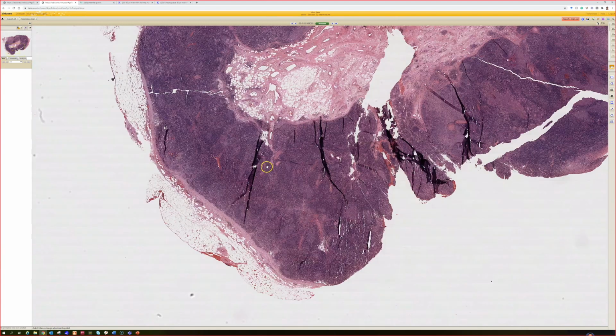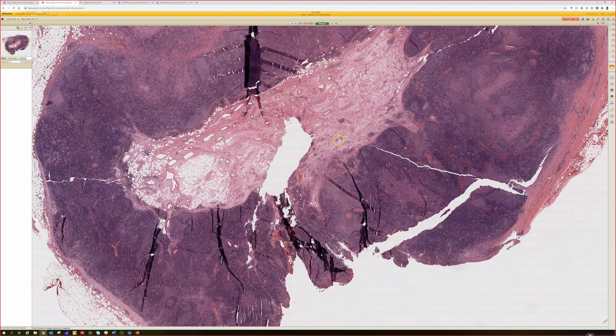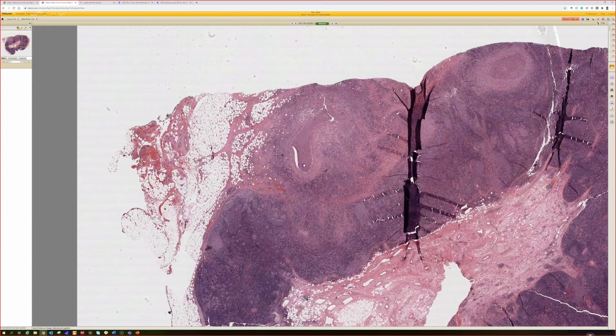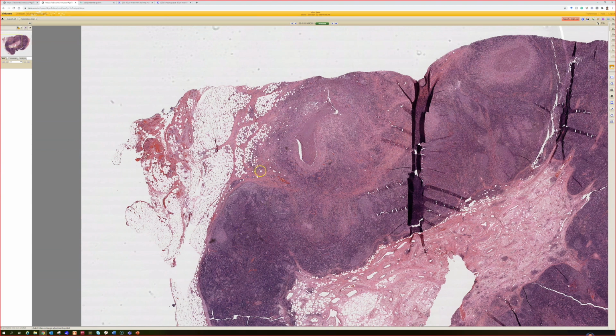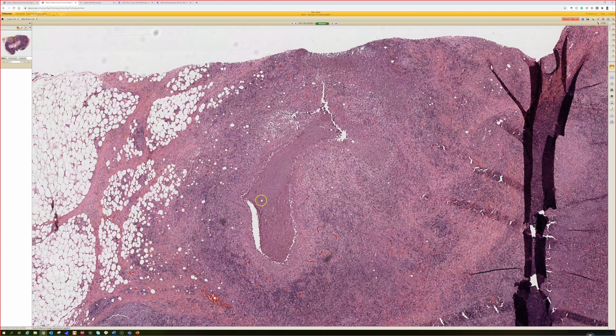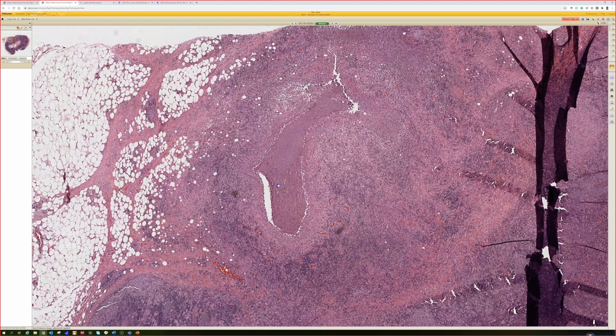So this lymph node, and I know you guys don't see lymph nodes really ever, probably, but this is not normal. These structures right here do not belong, okay? The rest of the lymph node to me looks like a big reactive lymph node. Again, I'm not a hematopathologist, but what are these structures? And I think you know these because you can see these in skin too.